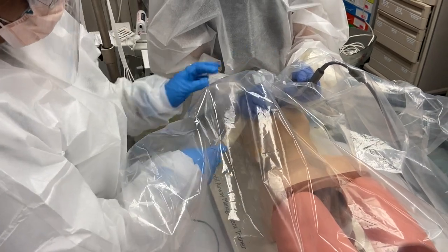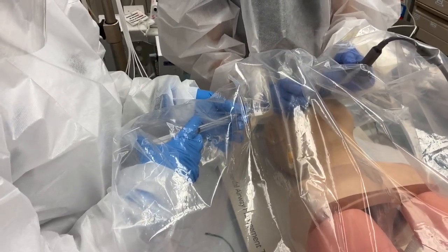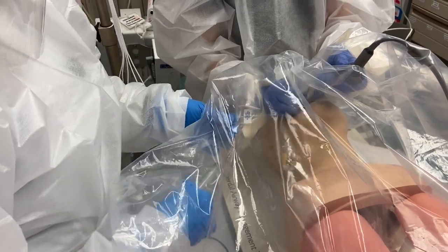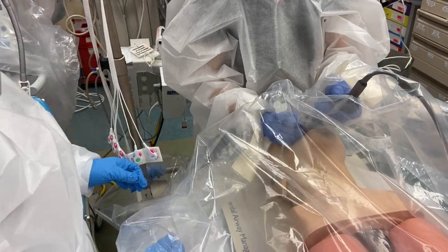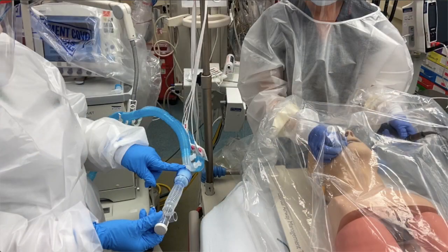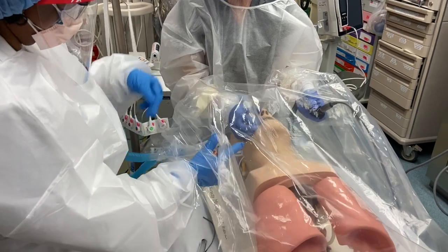After the stylet is removed, the cuff is inflated. The respiratory therapist will then connect the patient to the vent. Notice the HME filter. Not pictured is the end-tidal CO2 adapter, which should be connected.